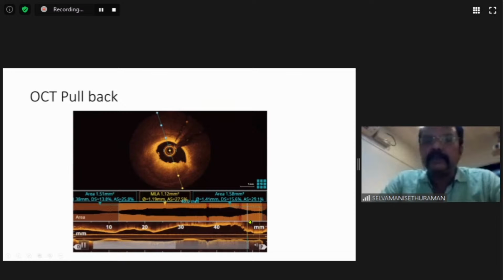If I had to put one more stent, probably it adds a lot of problems, where in the ostial LAD to left main, I have to put a stent. But imaging clearly showed stent under-expansion, which is a clear cause. And then after dilatation, the stent was well expanded, and we have just left it like that.